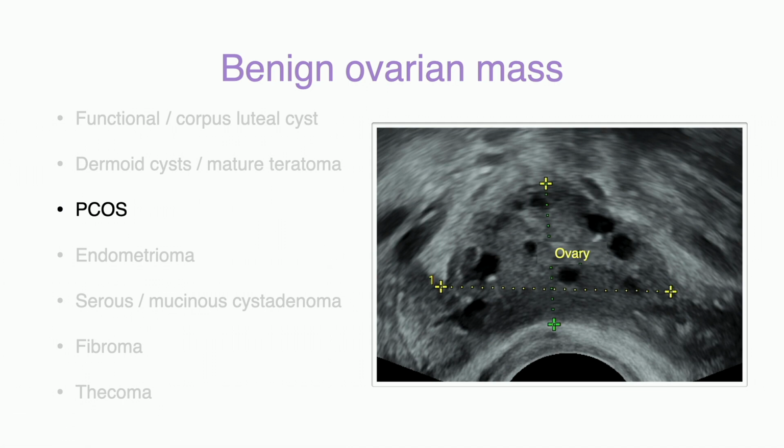Another common finding are women with polycystic ovaries. On this image, we see an ovary with lots of follicles. To count the number of follicles, you would need to scan through the whole ovary. If the follicle count is above 20, you might suspect PCOS. However, the exact pathway of diagnosis will be explained in the bachelor class.